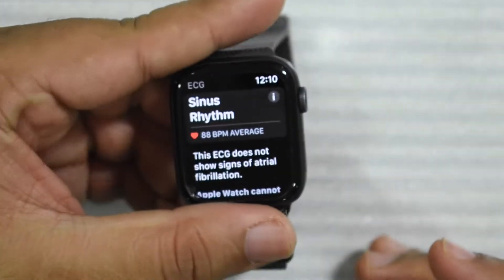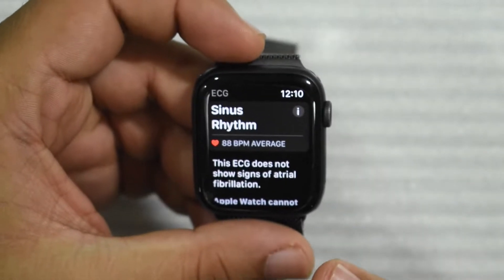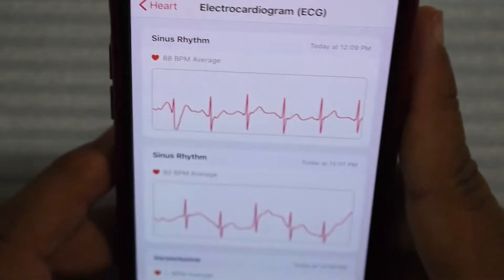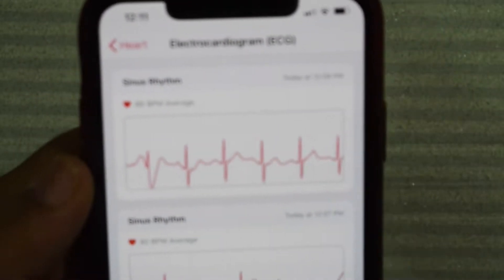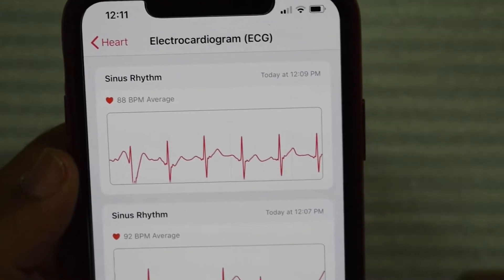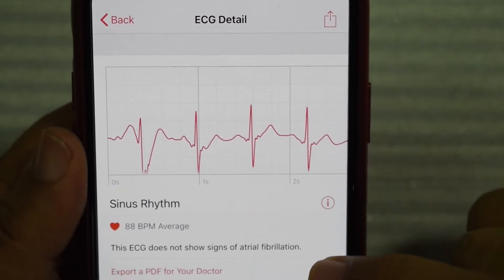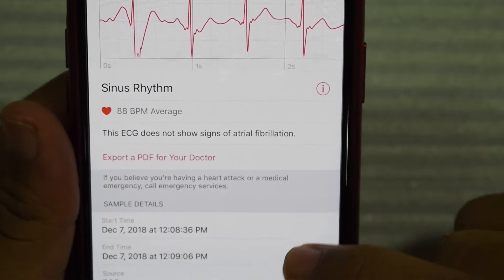That's a demo of the Apple Watch Series 4 ECG feature. I've been waiting for this forever and I'm so glad we finally got it. Let me show you what the ECG results look like on my phone. You can see my last result — the sinus rhythm. If I tap on it, you can see the ECG detail. The ECG does not show any signs of AFib, and you can export a PDF for your doctor.